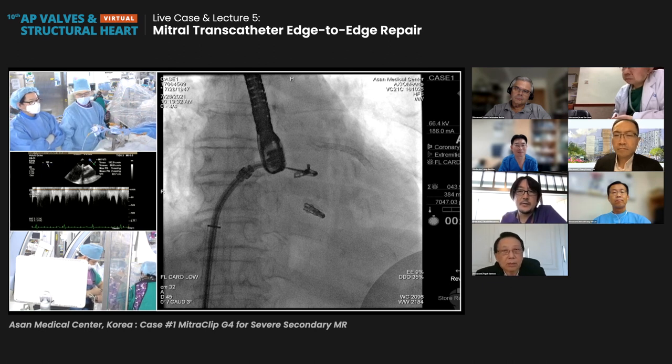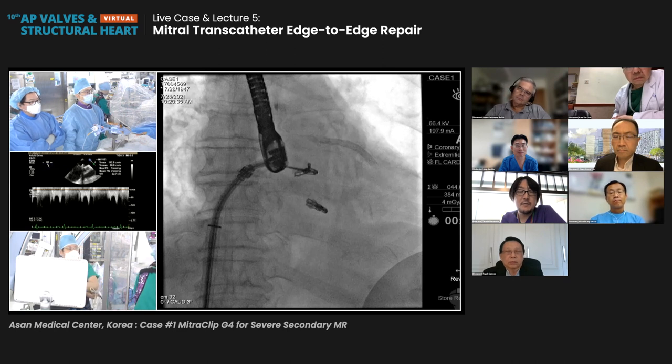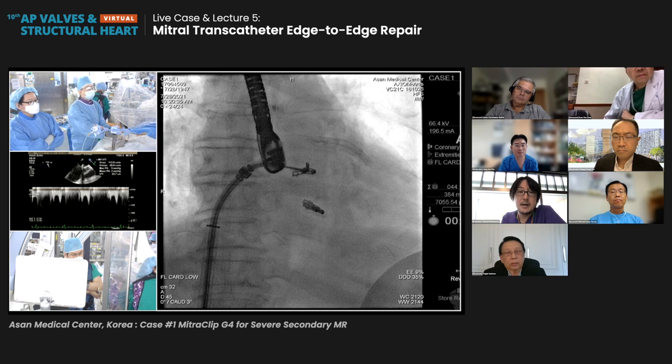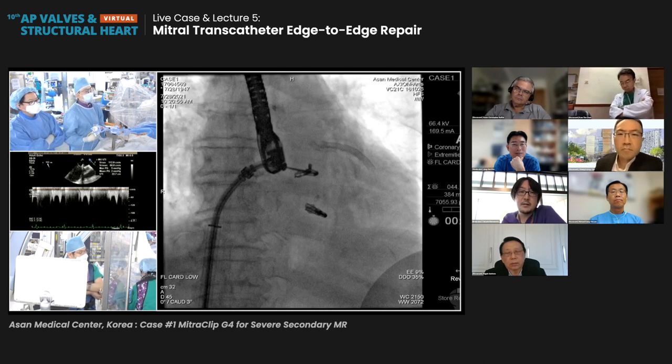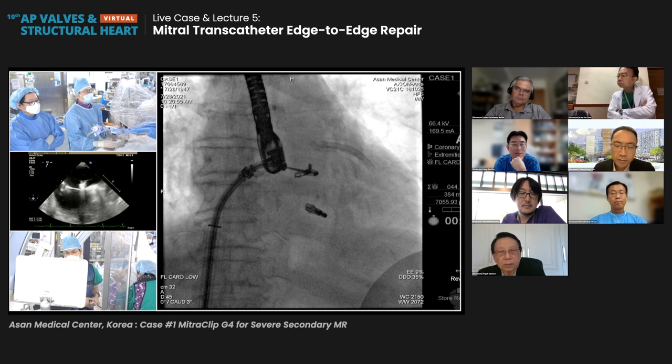So I try to puncture the pure posterior side, mid posterior. After we started to use the G4 system, most cases we can finish with just one clip deployment, NTW. So I don't care about height, because if we needed to deploy 2 clips, the second clip needs more height. But after G4, I care more about rotation. Yeah, I think rotation is of more concern if you choose to use the XT.